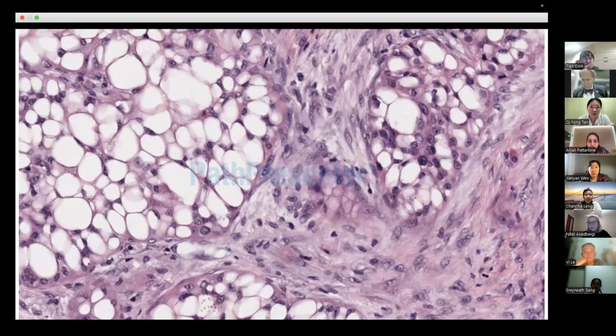So those ones, let's see, adenoid cystic carcinoma. It's a very good thought because it seems like we're having cystic structures, but remember, what you're seeing in these cells, this is very high power, by the way, is like a single cell.